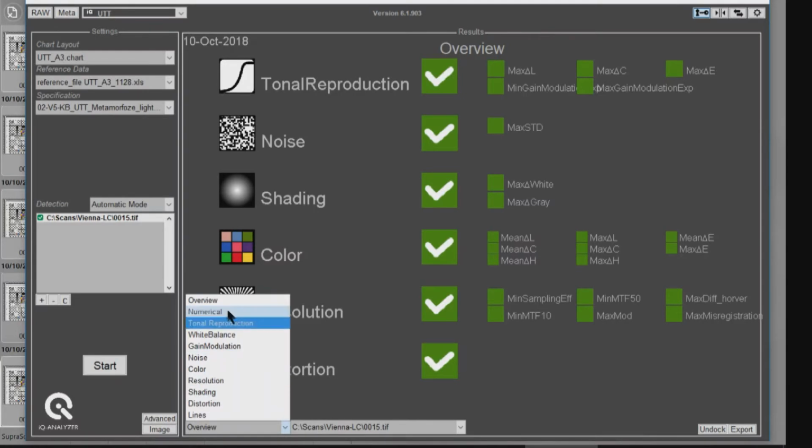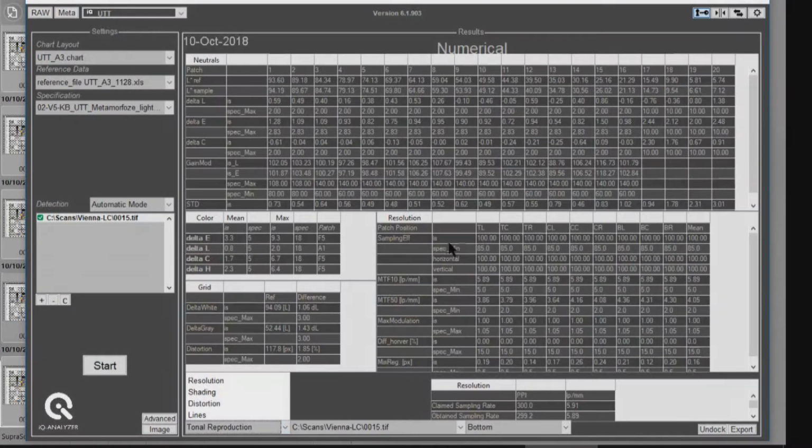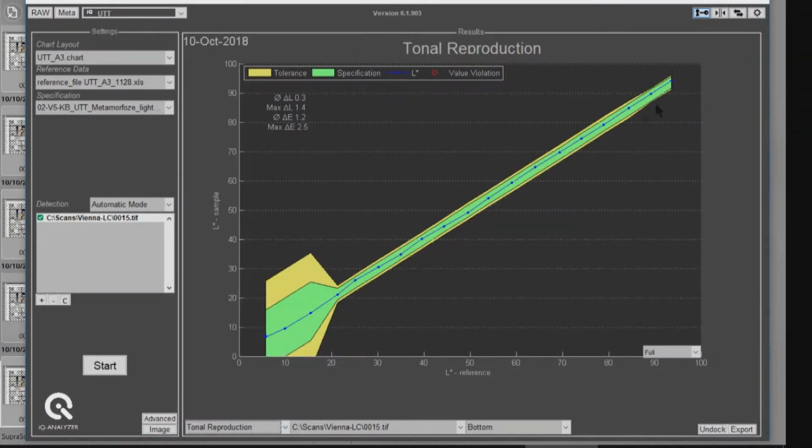So it's good at the beginning to check the numbers, or at least to check, for example, here. Here it's easy to see that we are in the middle. So if there is a small change, we'll still be within the green area. If we were, like at the beginning, very close to the top, that means one hour later it can be out. After that it should be stable. If not, you cannot use these standards. If it doesn't work, that means there is something wrong somewhere. Either you have selected something too tight for your scanner or for your scanning process.